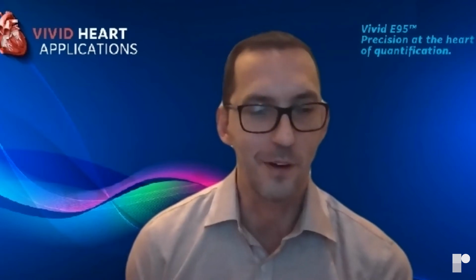I'm one of the clinical leaders here at GE Healthcare Cardiovascular Ultrasound, and welcome to another one of our Vivid Talks. Today, we're going to be talking a lot about some of our Vivid Heart applications around left atrial quantification, left atrial strain, LA strain, and 4D LA volumes, or what we call 4D LAQ. But first, let me introduce our speaker for today.